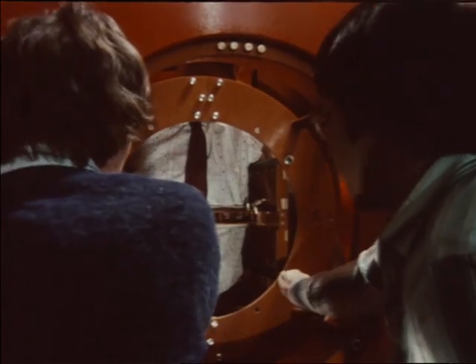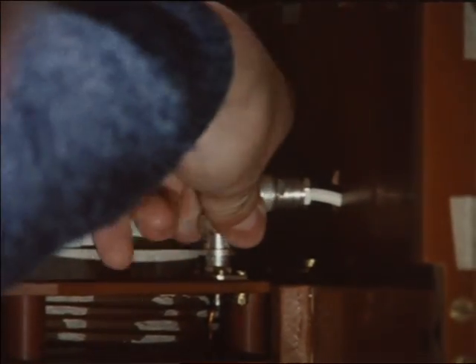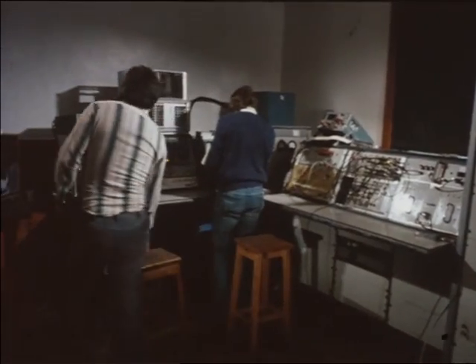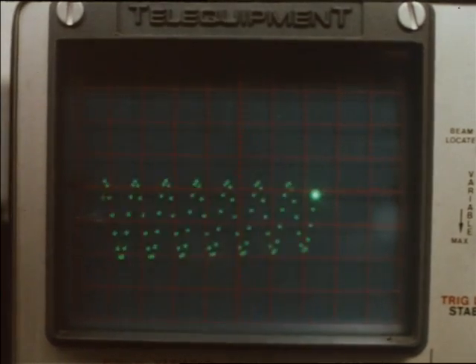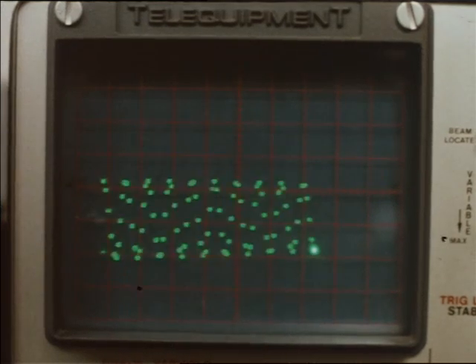Once bolted into the apparatus, the receiver coil is connected, and the process of building up a picture can start. The radio pulses are injected. Their frequency slowly alters to gain more information from the body inside the magnet. The process takes about 30 minutes, but the workers here are confident that it'll soon be reduced to a matter of seconds. This is one of their first pictures of the human body.